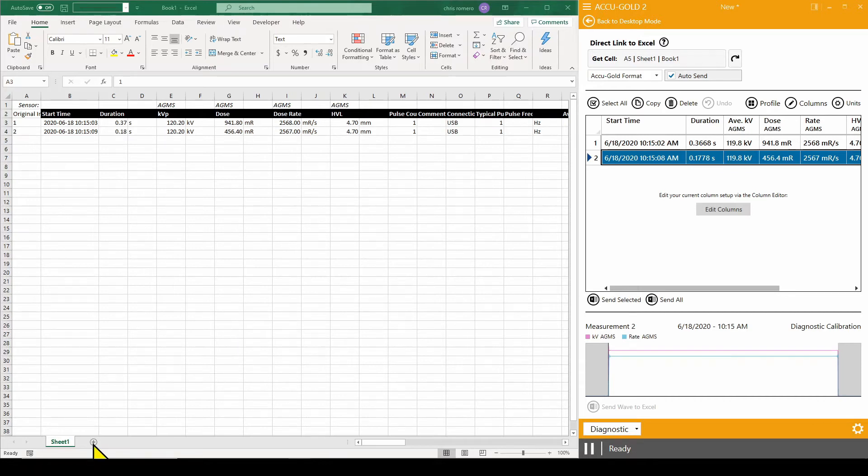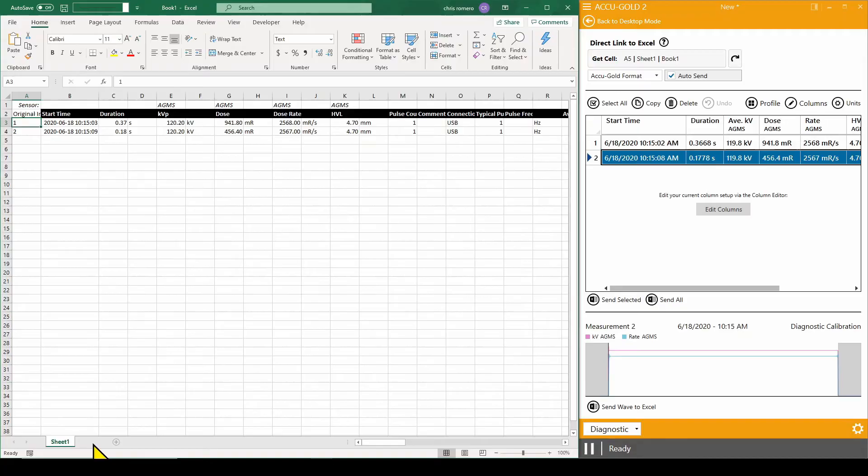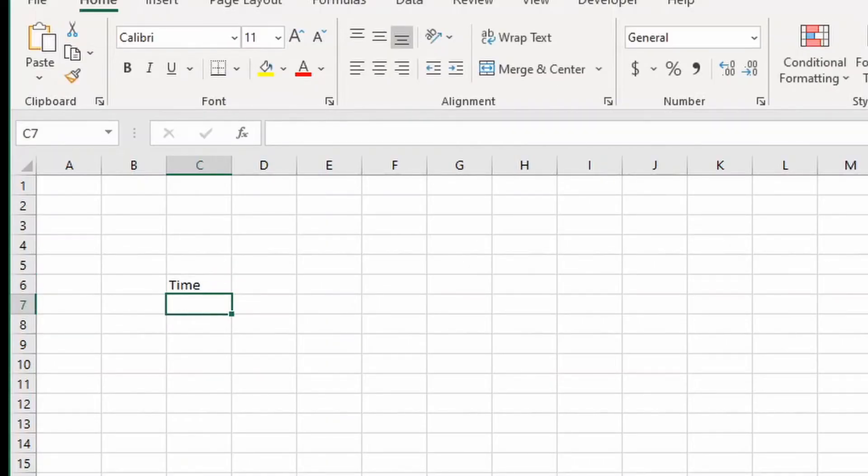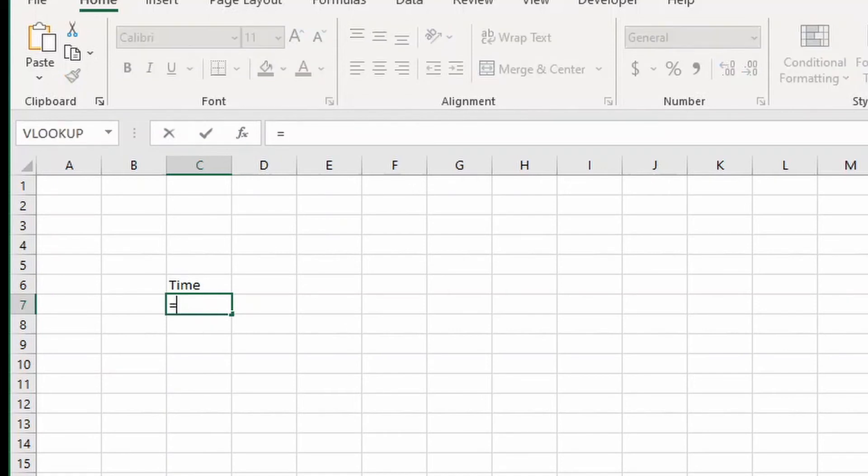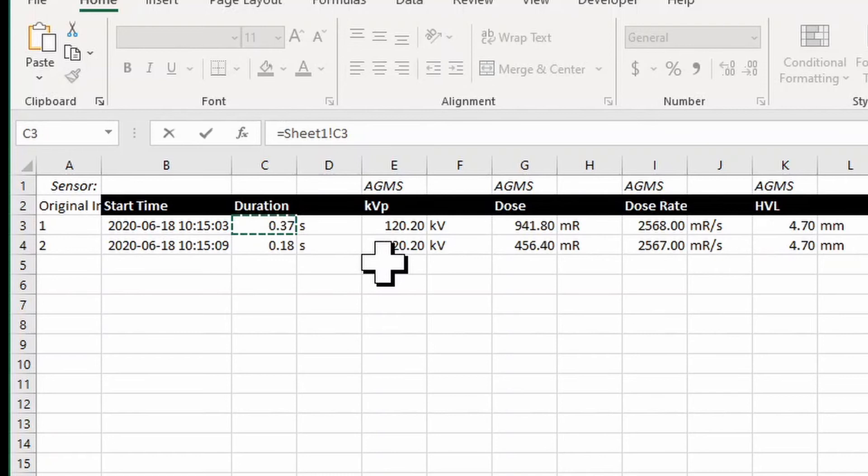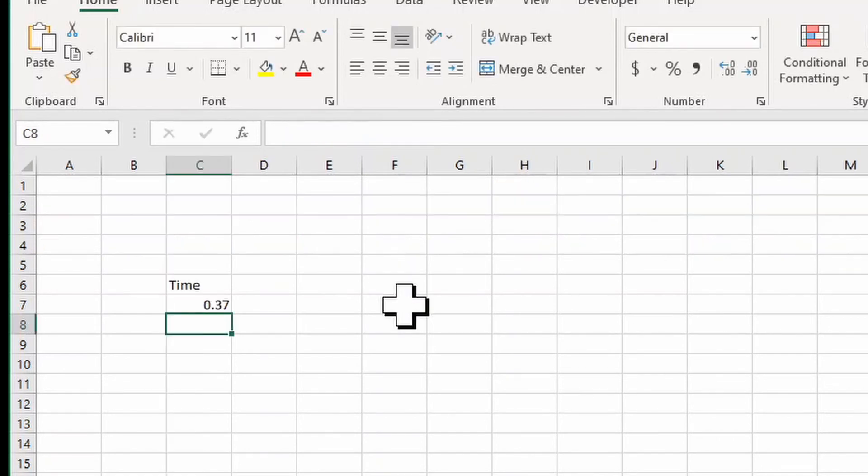To demonstrate, we will use a blank sheet. I will set up three outputs. The first will be time. Select the cell under the header and press the equals key. Then go back to the data sheet and select the beginning output cell under the time header and then press enter to set the reference.